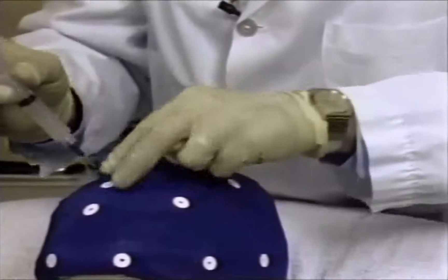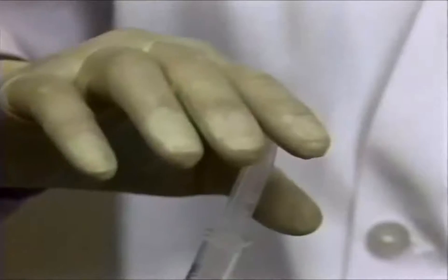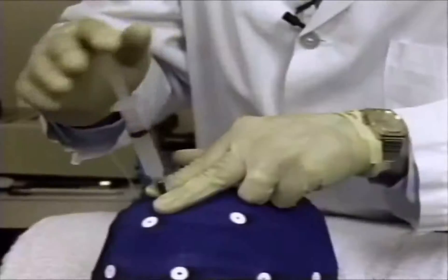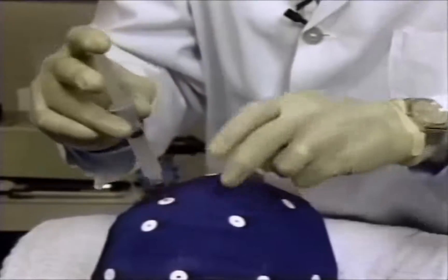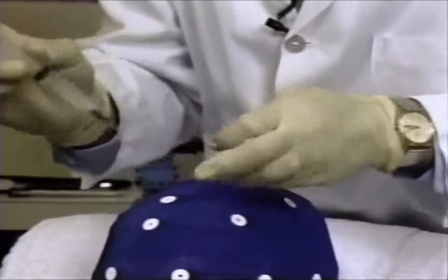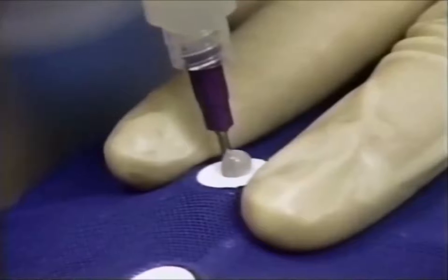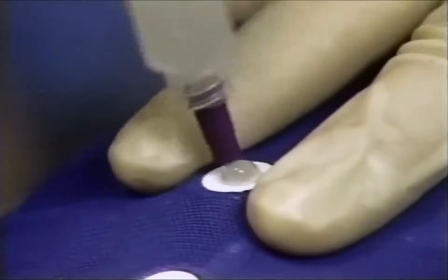While holding down the electrode, place the opposite index finger on top of the syringe and using moderate downward pressure, rock the syringe back and forth. The excess gel is then wiped off, and the process is continued until all the electrode sites are filled and the scalp is abraded.